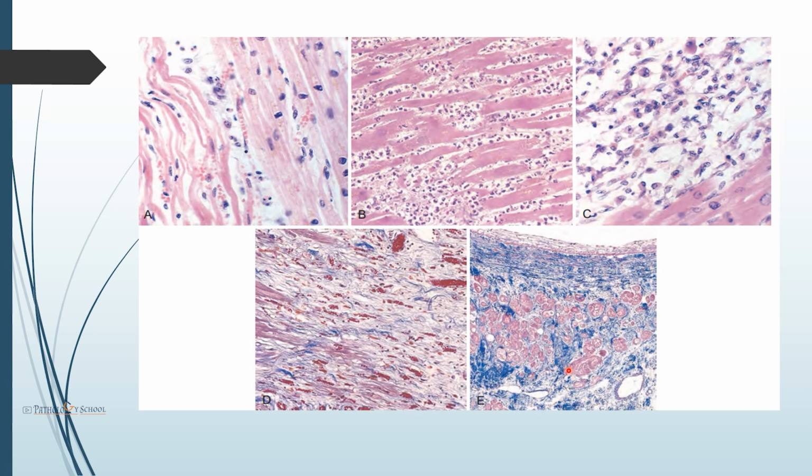This is a microscopic picture in myocardial infarction. This is a 1-day-old infarct showing coagulative necrosis and waviness of the fibers, wide spaces between the fibers and edema fluid with scattered neutrophils. This is a 3 to 4-day-old infarct picture showing dense neutrophilic infiltration.